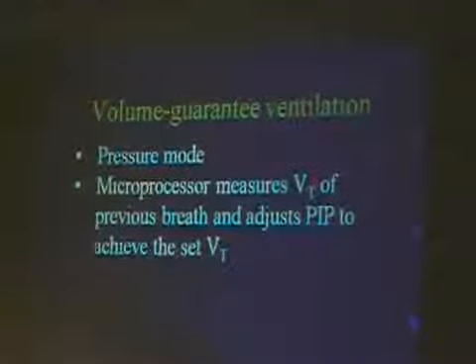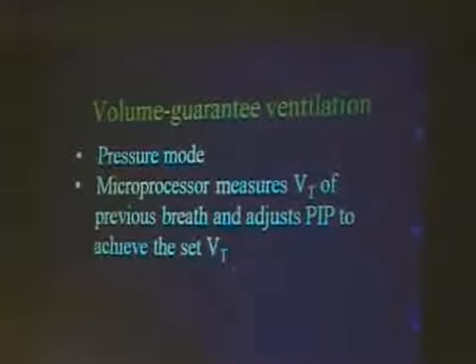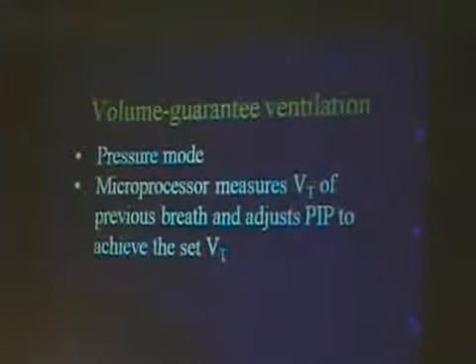So I think you can see how valuable that could be. If giving too much tidal volume is so dangerous, and it is, then if we can adjust our ventilator constantly so that our tidal volume stays where we want it to be, the chances of lung damage are less. And in fact, the meta-analysis that I went over with you briefly shows that.